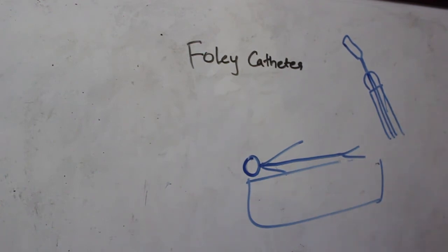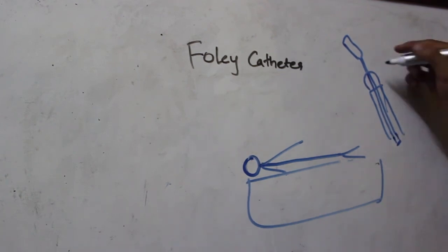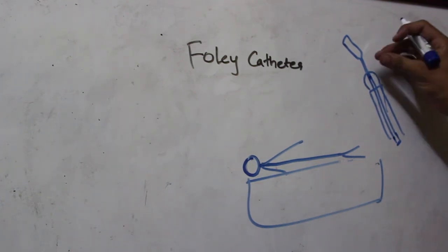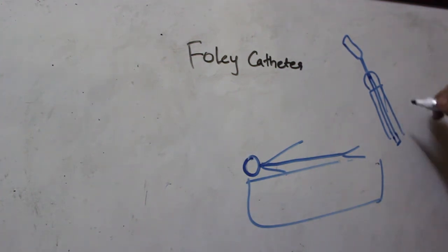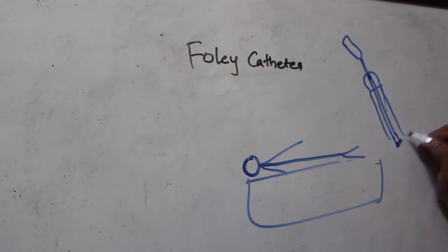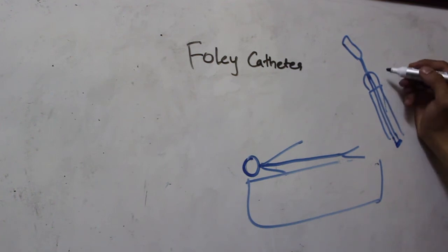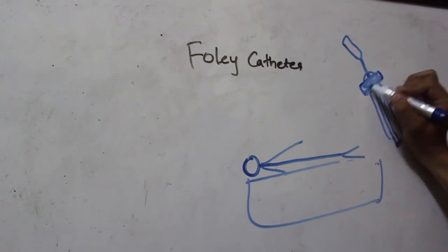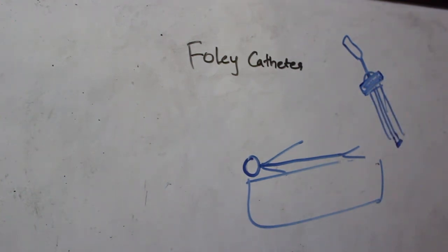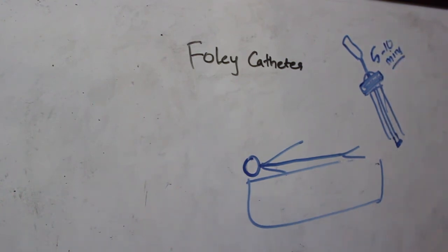anesthesia inside the urethra, there are strictures, so you have to pass this from this to this. So you have to massage the penis from the anterior to the posterior area, to make sure that it reaches the sphincter area. Now after you have put in the anesthesia, you have to clamp the tip of the penis with a penile clamp, or you can pinch it with your hand for 5 to 10 minutes so that the anesthesia can work.